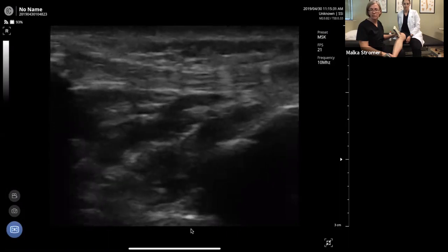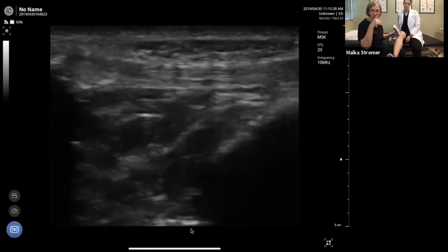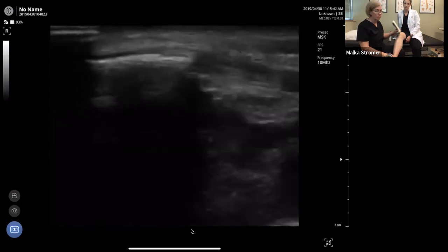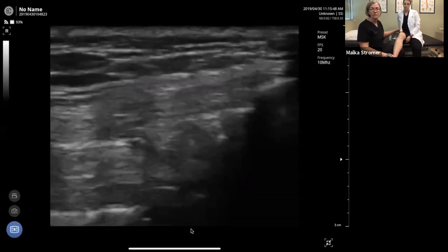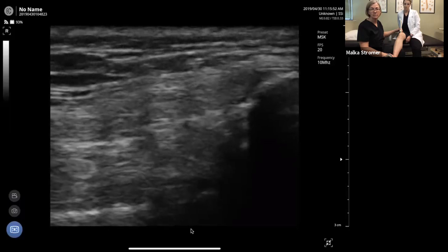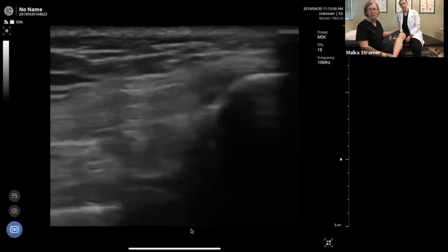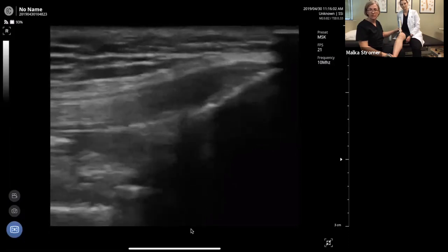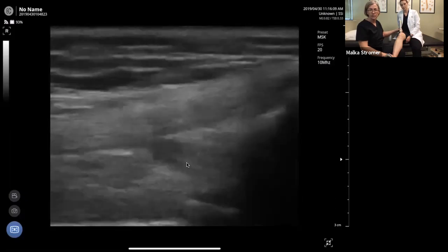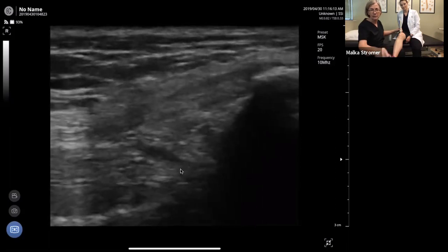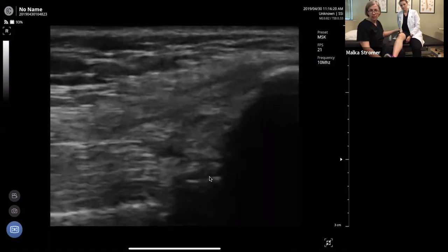In Osgood-Schlatter's, there will be very hypertrophied tissue with a lot of bony prominence in that area, but this looks excellent. The ACL is down deep — I don't tend to look for the ACL, as that's generally an MRI call, although with extreme flexion you can get down there. Then we'll come proximal over the patella into the distal quad — increasing the depth just a little. We have the distal quad attaching to the patella, with the femur down at the bottom of the screen.